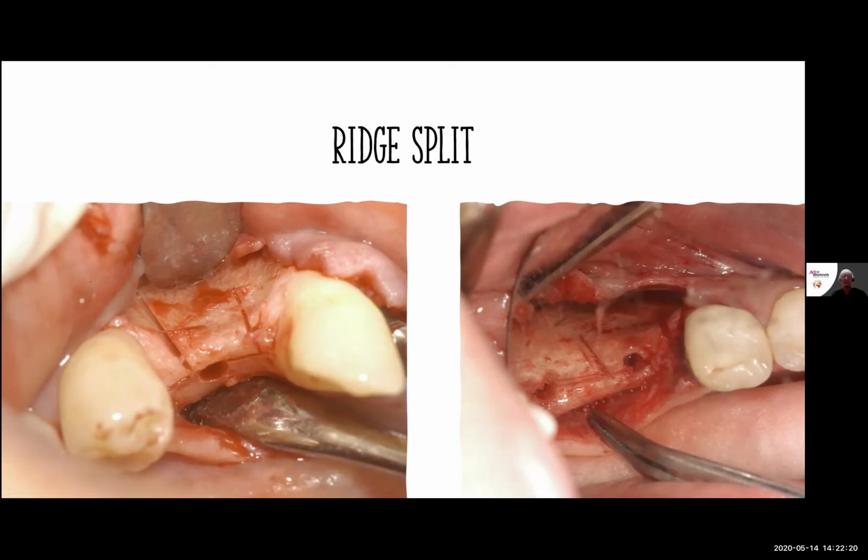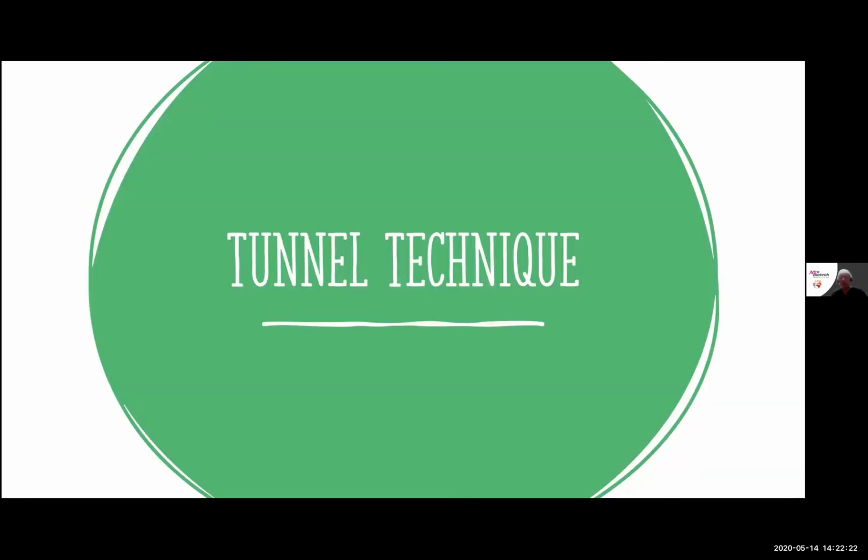Releasing as far down as the implant is typically what I do suggest with the length of your releasing incisions themselves. The tunnel technique, which is what we're going to spend the remainder of our time on here, is looking at this. The tunnel technique is not a new technique. It is one that I learned when I was in dental school. It is a technique that has been used for a variety of things, in adding extra gum tissue underneath, or adding bone underneath.